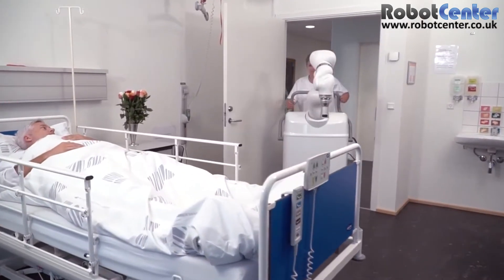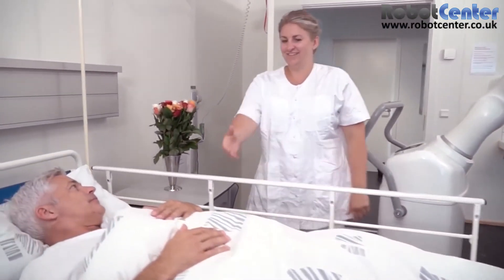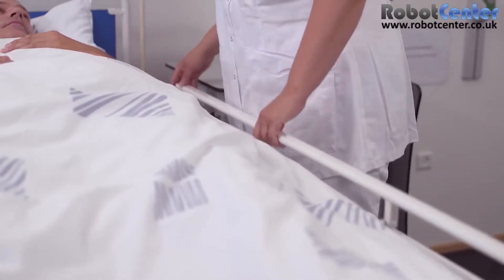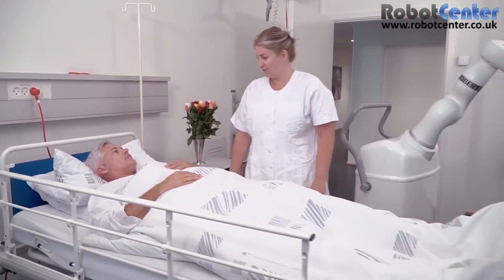Robert is a rehabilitation robot designed to attend to the early mobilization of patients who are confined to their beds. It is important to initiate rehabilitation as early as day one of a patient's hospitalization, even though the patients may be weak and incapable of getting out of bed on their own.